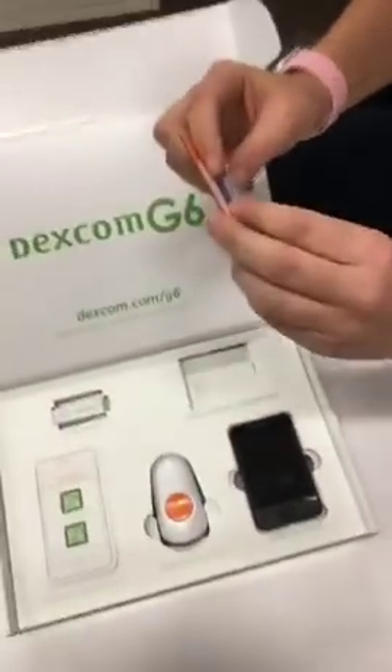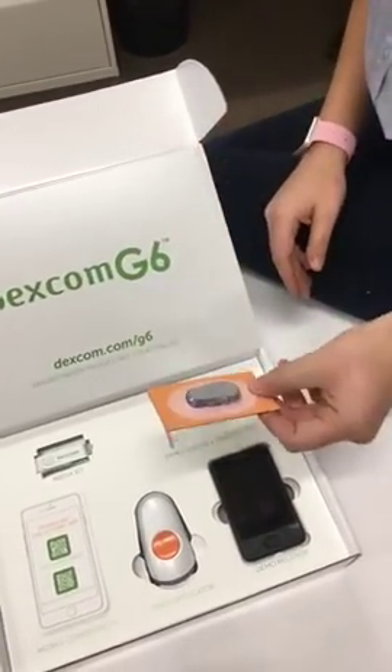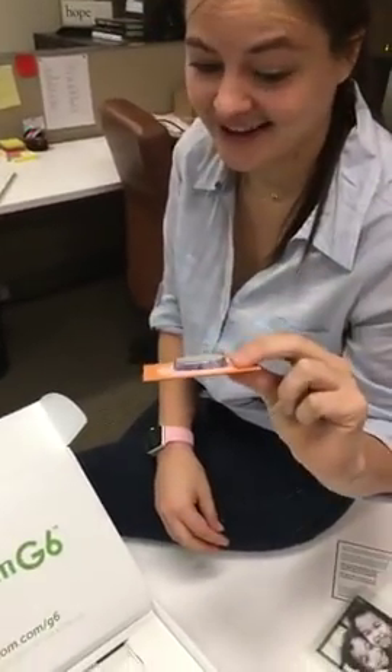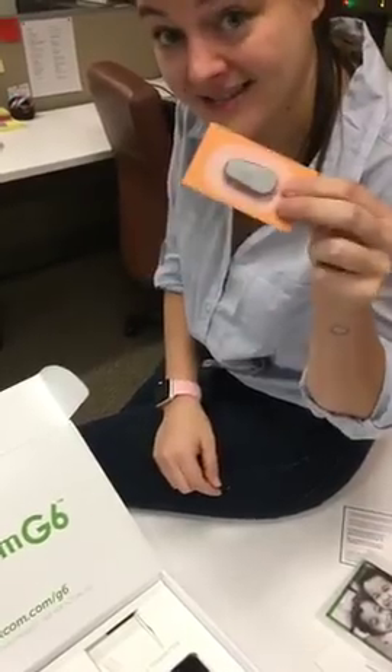This demo one doesn't click in and work because it's just the demo, but it gives us a nice sense of how big it is. If you guys have used Dexcom, you know this is a lot smaller than the current transmitters, which are a little bit more bulky. This is a huge step up.